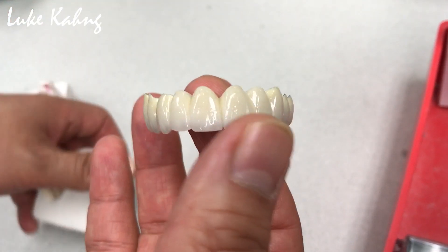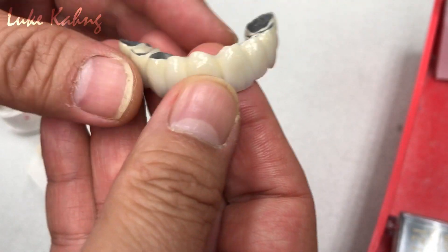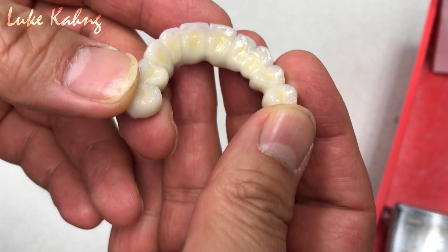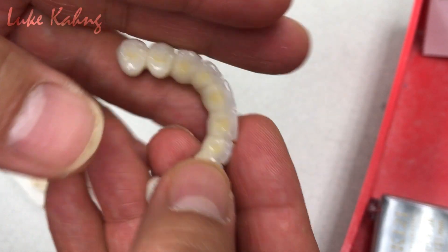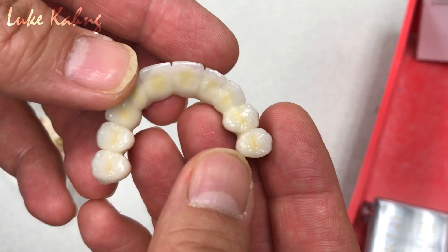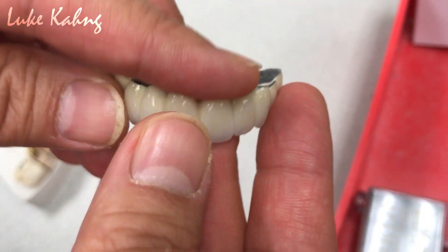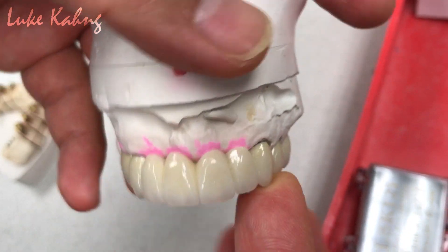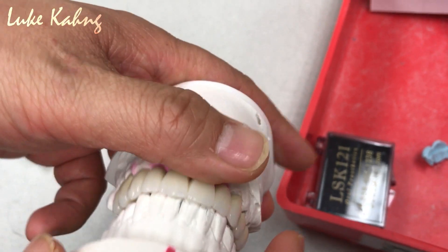Ten-unit porcelain fused metal bridge. After the try-in, finished it. Great aesthetic and great contours. Posterior occlusion is done. Finally done. Just letting you know your shader.